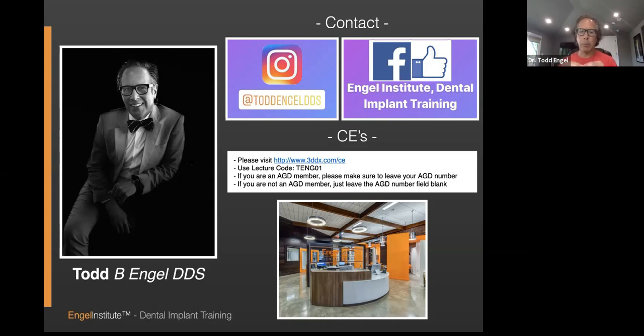And then we are going to open, here's your question, Doc, a 500 milligram tablet of tetracycline. It's going to look literally like a pixie stick or yellow powder. Put it in a dappen dish. Put in some sterile water, you can use saline too, and mix it up so you have yellow water. Put in your cotton pellets. The less water that you have to put in to saturate it is better, because then you'll have more potency from the antibiotic. Get yellow clumpy cotton balls and shove them in around the implant threads, all the way everywhere where you can reach, and leave it in for 5 minutes.